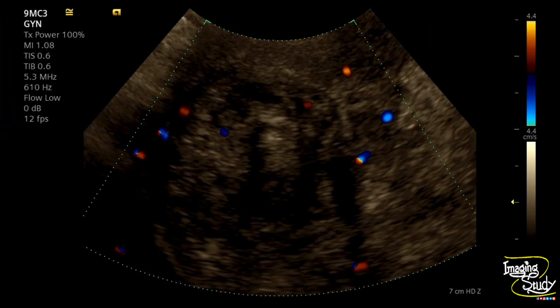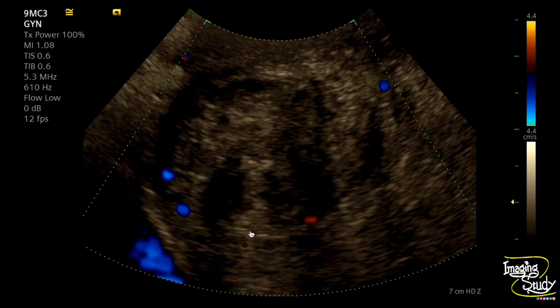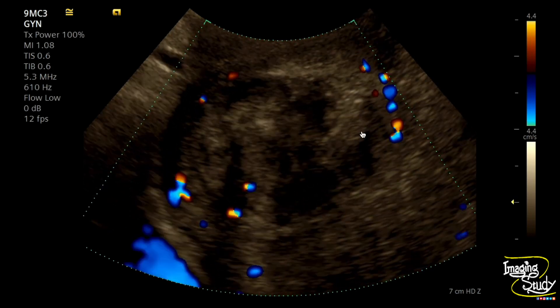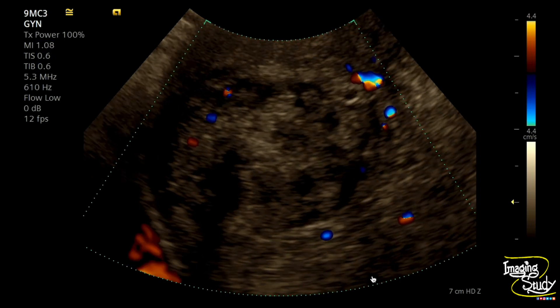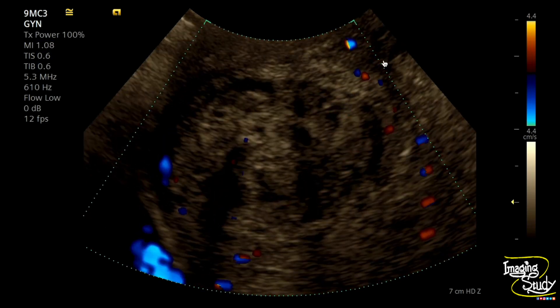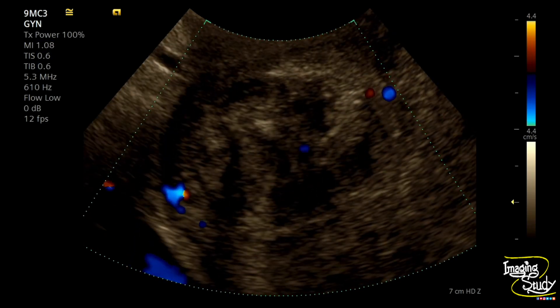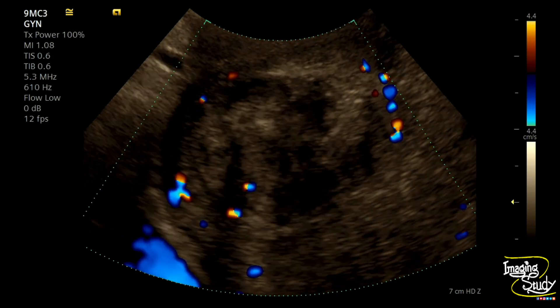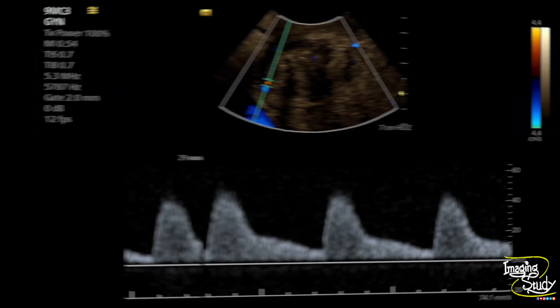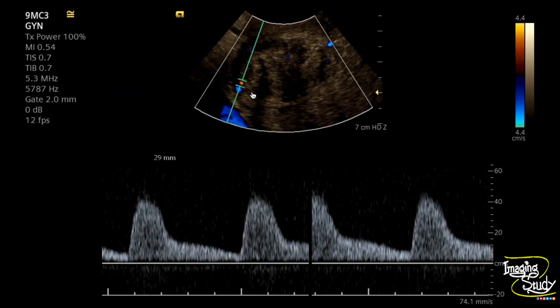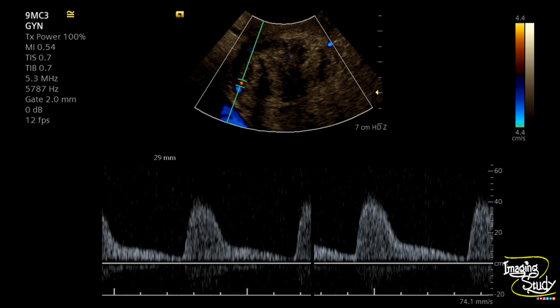Here we have put the color Doppler. You can see predominantly peripheral flow towards the fibroid, as it is a benign lesion. Now we want to take a sample from these supplying vessels. We have chosen one artery and you can see it is showing moderate resistant flow.